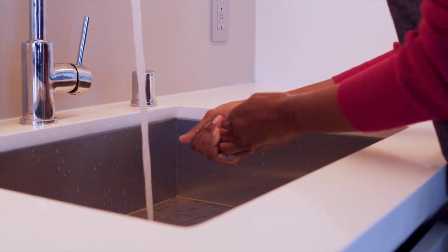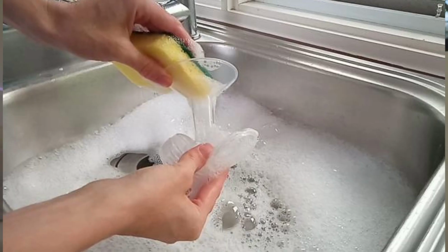Hygiene is really important before pumping, so always wash your hands before commencing expressing. When you're cleaning your pump, you can clean it with hot soapy water. I would personally use a toxic-free mild dish detergent, and then rinse in cold water and air dry your pump parts between use. Make sure you're also watching the little valves that come with breast pump parts, as they can collect a lot of built-up milk and bacteria if not washed between use.